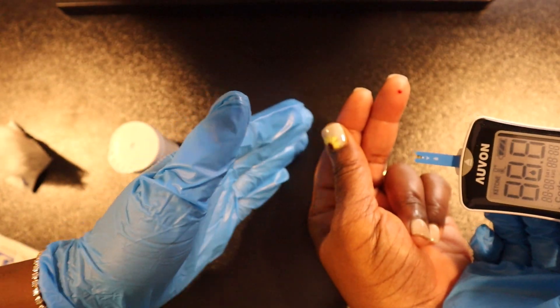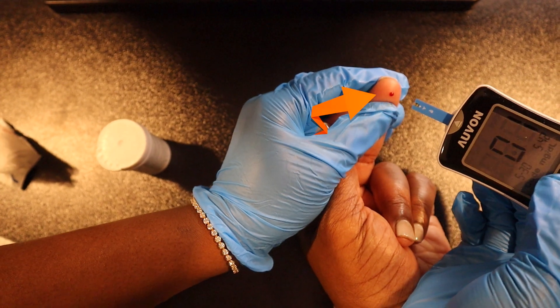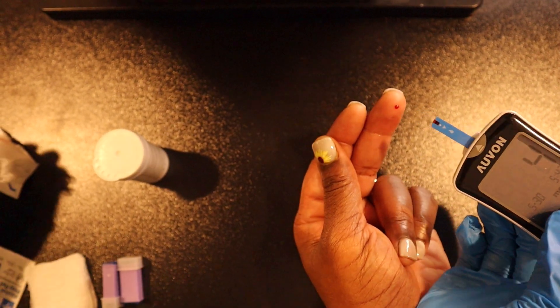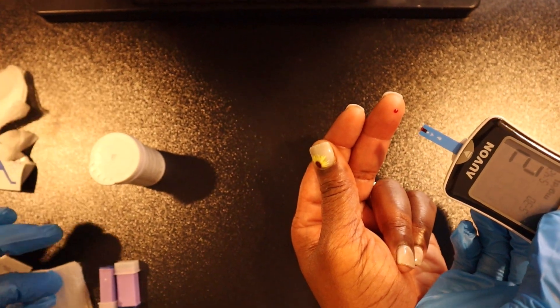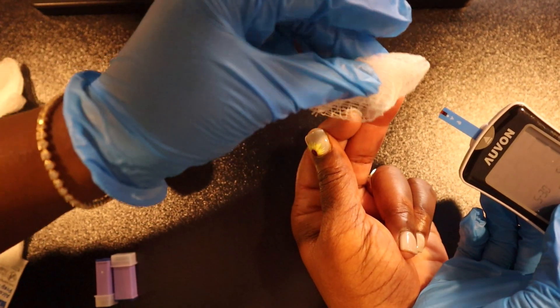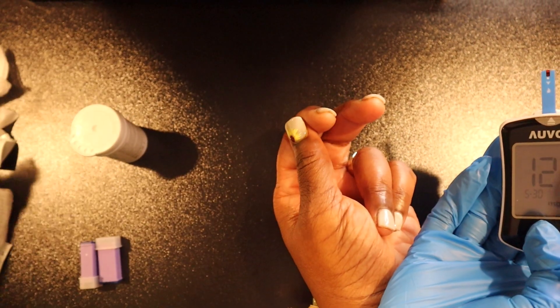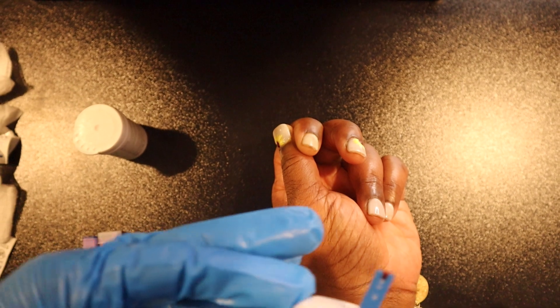Let's place the test strip inside of the glucose meter. We are going to place the tip of the test strip against the drop of blood — the test strip will detect the blood and automatically absorb it. The glucose meter will take about five seconds to analyze the blood and then give you a number.